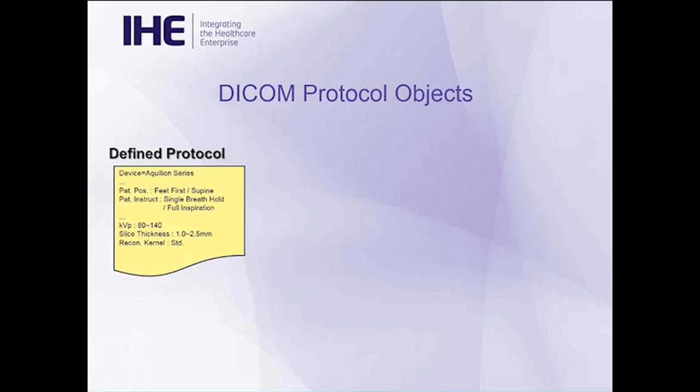So the DICOM protocol objects, there's what we refer to as a defined protocol. This is before you've done a scan. You can list out what type of scanner it's appropriate for. You can give details like patient instructions and patient positioning. You can include technical details like what the KVP should be. And we'll talk about this a little bit in the next slide, but you can put in constraints.